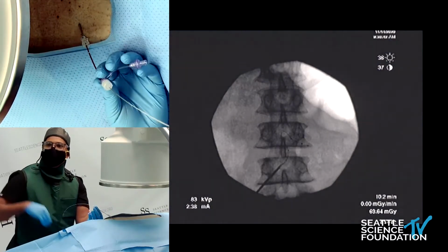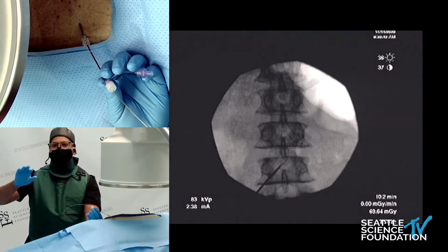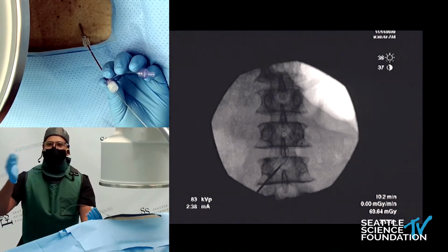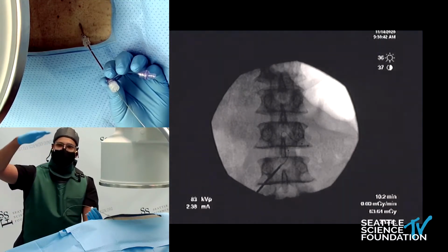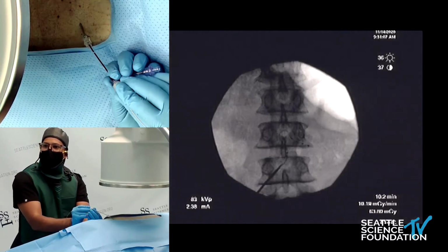And I'm going to actually here in this position shift everything over. You can see here my needle bevel is pointed towards the right, but my sheath is still curved left. And a big part of that, again, is fibrosis. In a live patient, you're going to have a lot more epidural space, more fat. So there's going to be more room to basically maneuver. But right now, because everything is compressed, these cadavers have been sitting for a long time, things don't want to turn very easily. So we'll just try to work with what we have.